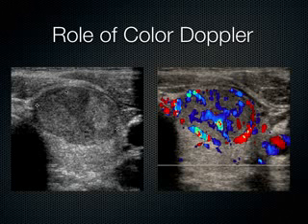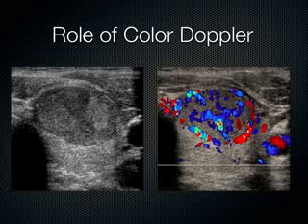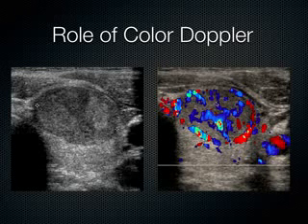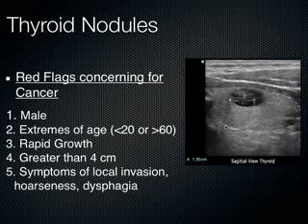On this image over here, we just see a predominantly solid thyroid nodule. So this is normal looking thyroid down here, and this is all this solid looking nodule here. And then we add some color flow Doppler here. The carotid lights up a little bit, and we can see marked internal vascularity, increasing the likelihood that this is a malignant nodule, and indeed after biopsy this turned out to be a papillary carcinoma.